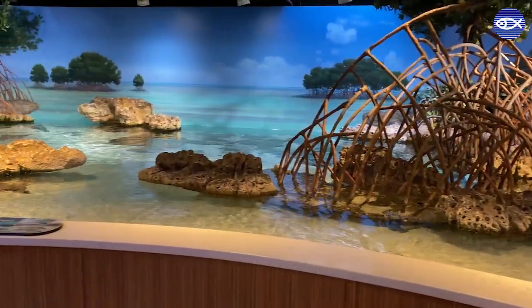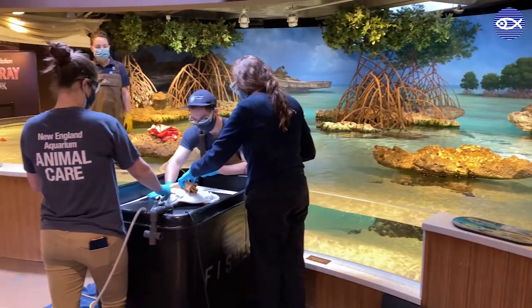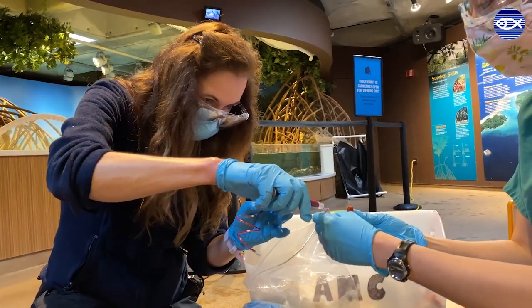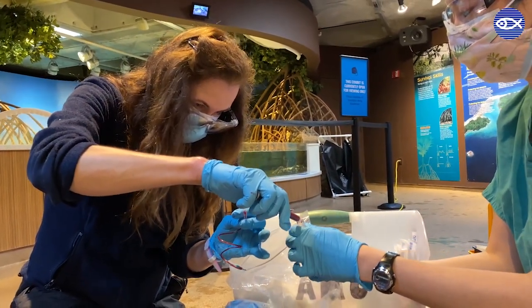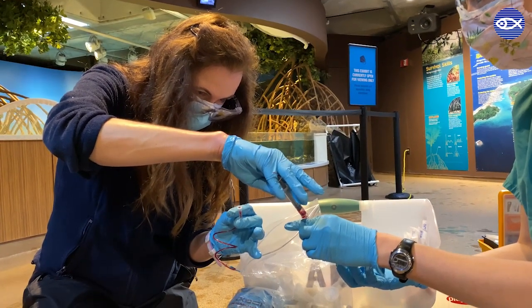Welcome to the Shark and Ray Touch Tank at the New England Aquarium. I'm Dr. Kathy Tuxbury, one of the veterinarians at the aquarium. To provide a snapshot of my work, I thought you could join us for a special procedure. Today we are performing exams and collecting blood samples from a few of our cow nose rays.